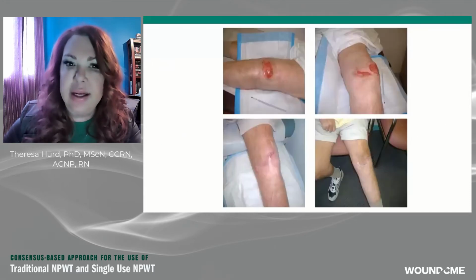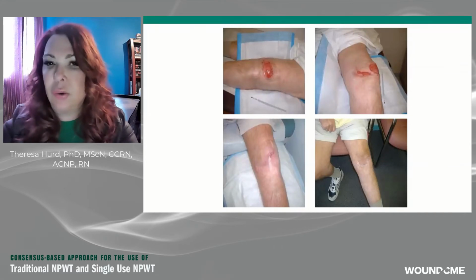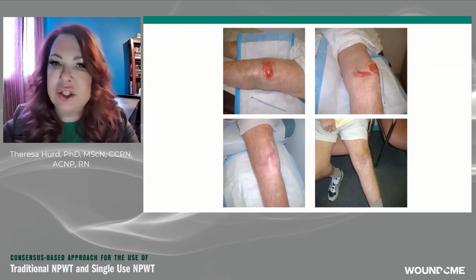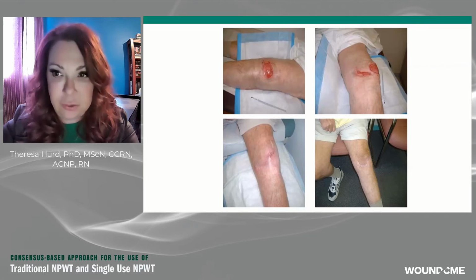I wanted negative pressure. You can see the upper knee, the wound that's open. And you can see it's open on a limb that's moving, on a limb that keeps constantly opening it up again. In addition to that, it was a knee replacement. So we do want our knee replacements to go through physiotherapy.